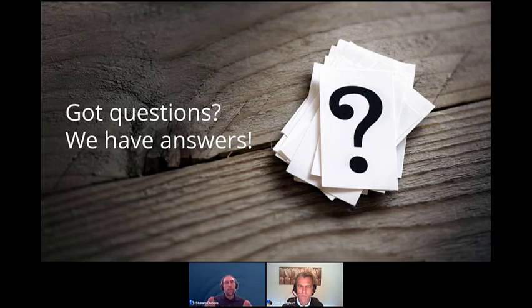And then at the top, there's the 49 large. Again, 48 of those are going to be the one size. And then that large well at the top is actually the 49th well. So you definitely want to make sure either tray you're using that you're counting that large rectangle well at the top as part of your test.